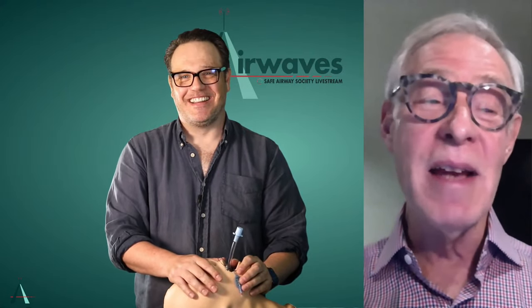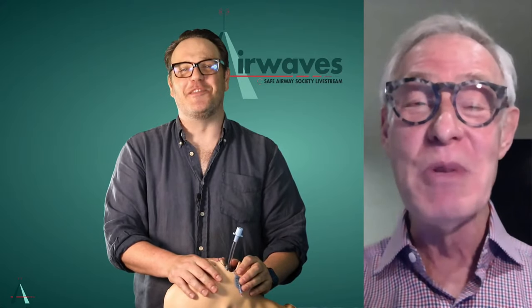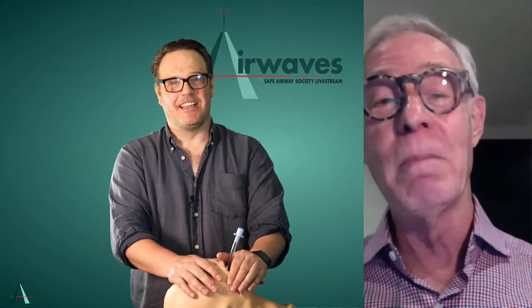Did I tell you about Indiana Jones and when he was confronting that guy with the turban and this wicked sword? And then all he did was pull out the pistol and shot the guy. I'm not suggesting you commit murder, but what I'm suggesting is if the epiglottis is in your way, just pick it up.